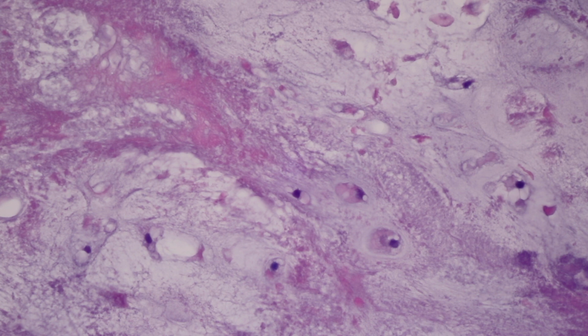Low-grade chondrosarcomas, you have increased cellularity. The nuclei change. They may be about 1.5 times the size of a normal chondrocyte nucleus, and instead of being dark, they now have very fine chromatin. You can see small nucleoli. And that is, from my perspective, a manifestation of nuclear atypia. Is it enough to make a diagnosis of chondrosarcoma? Absolutely not.